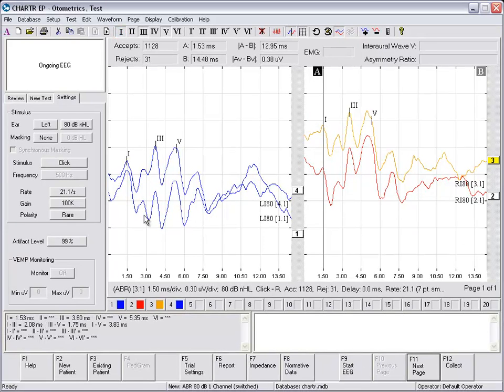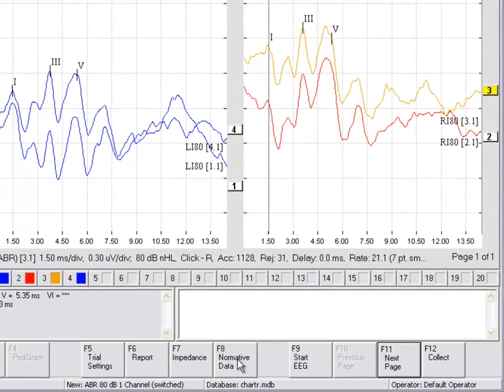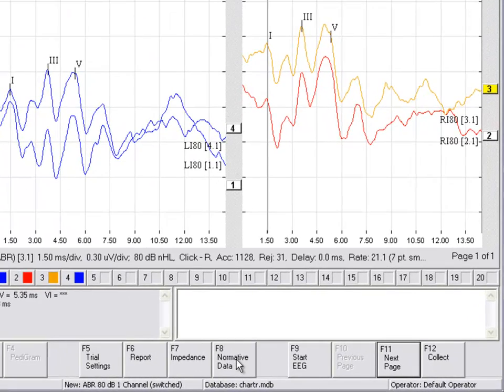If you'd like to use the Normative Data feature after you've marked Wave 5, you may choose that by selecting F8 or by clicking on Normative Data.